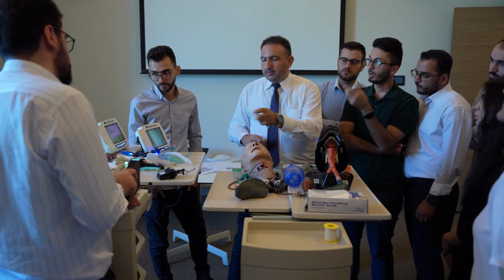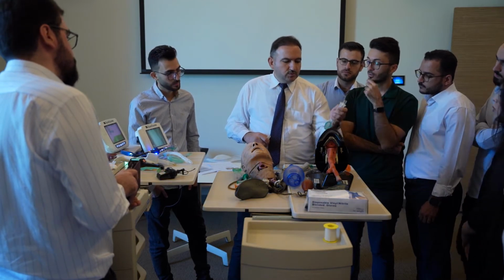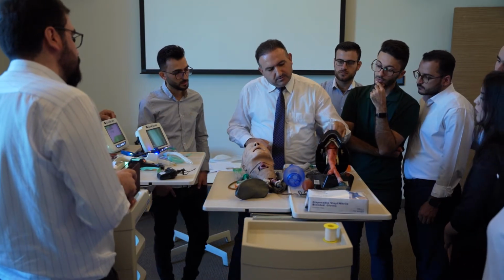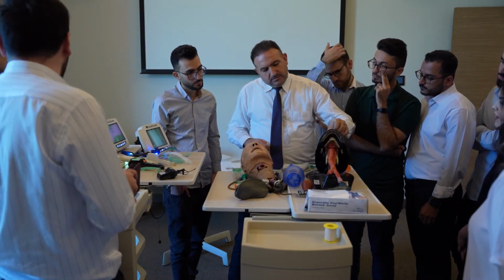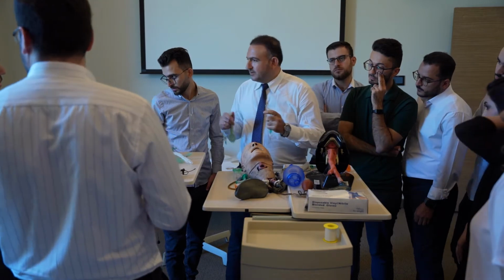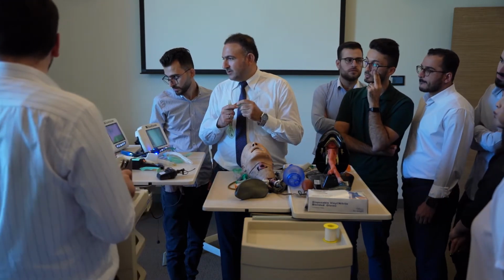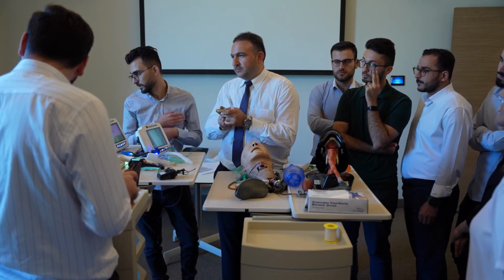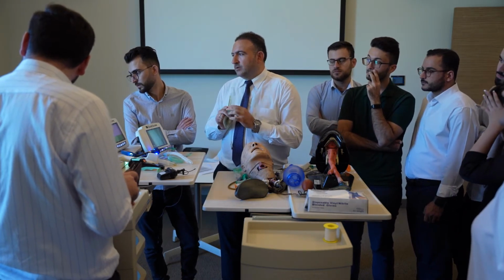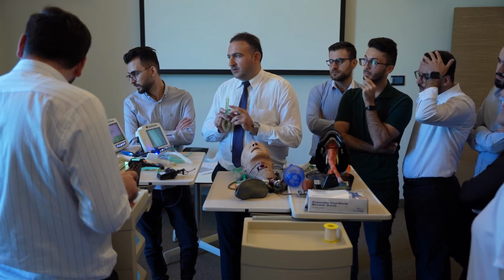How do we choose the size? How much do we go in, and how do we know it's really in the right place? When you ventilate, you should see elevation of the chest, because this will fit the Ambu-Bag, not the mask, when you use laryngeal mask airway or iGel.